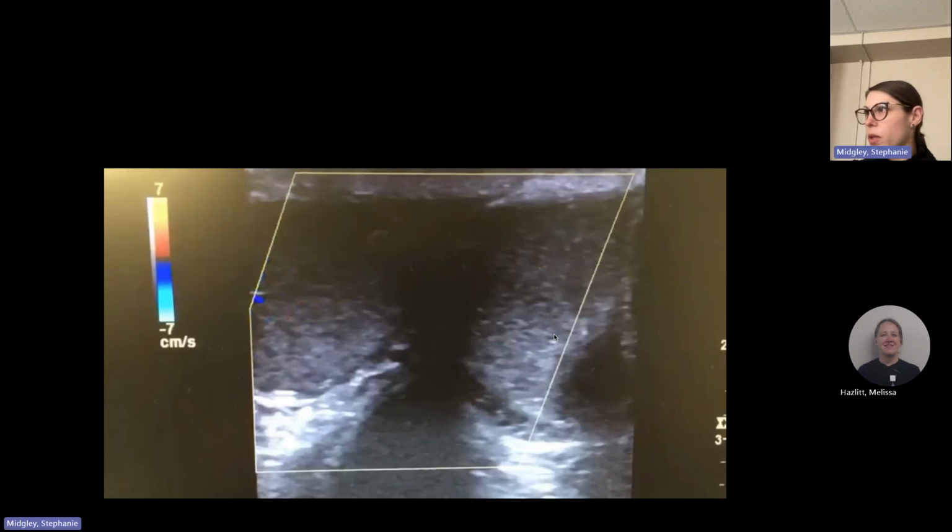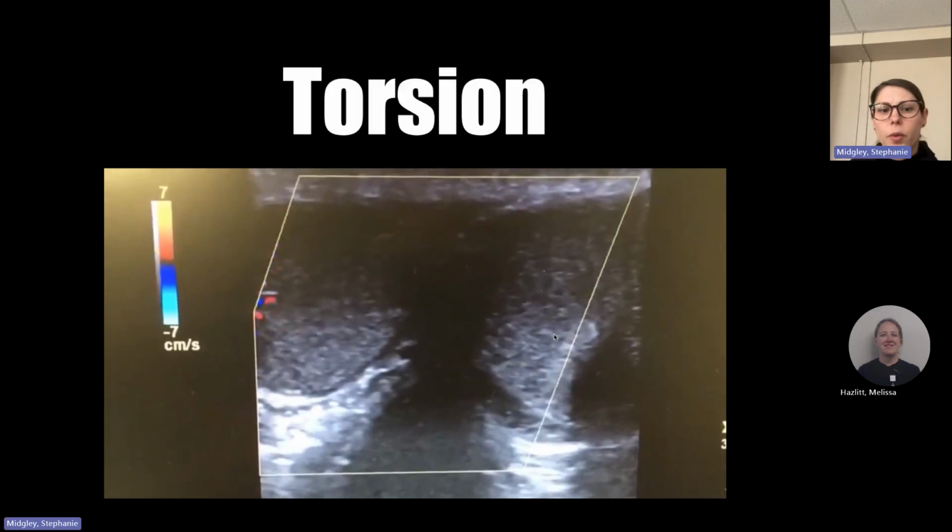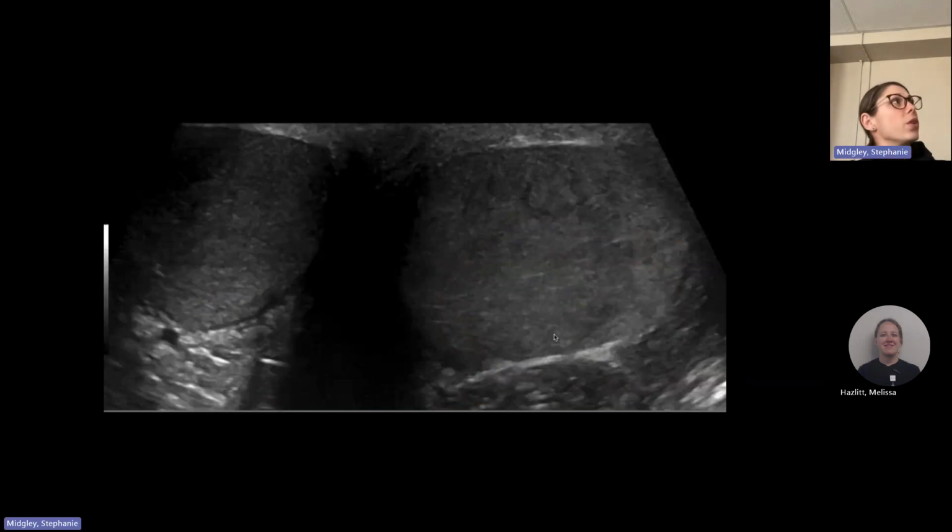Typically, the first thing that's going to go is actually the venous flow. So that's really important, that you're looking for both the arterial and the venous waveforms and not just the arterial waveforms. All right, so other things we look for when it comes to torsion. So the first thing you're going to notice, which testicle looks bigger? Yeah, the left one, right? So if you think about torsion, the flow can't get in and the flow can't get out. So the flow not getting out is essentially going to make the testicle swell. So your torsed testis is going to be larger.